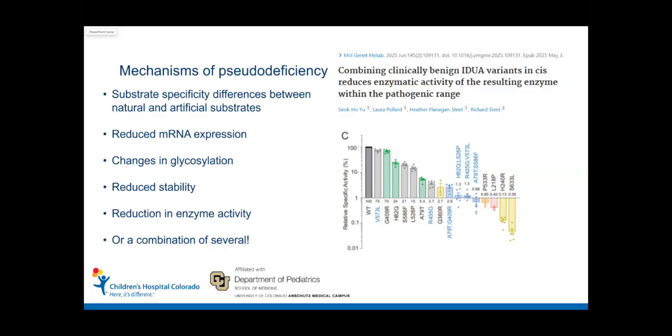It's expensive work, and it takes a little bit of time, but I really think it's something that as a community, we need to come together on and support Dr. Steet or others who are doing this kind of work, because it's really important to understand the biological consequences of these and develop a series of laboratory experiments that can help calibrate whether these are pathogenic or not.